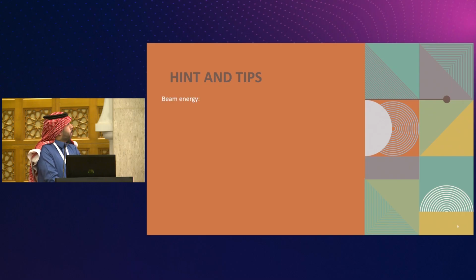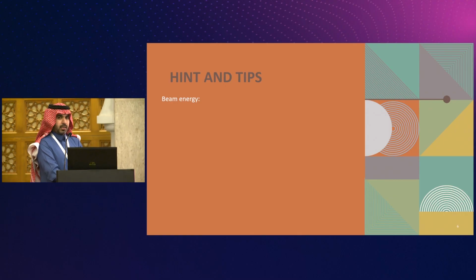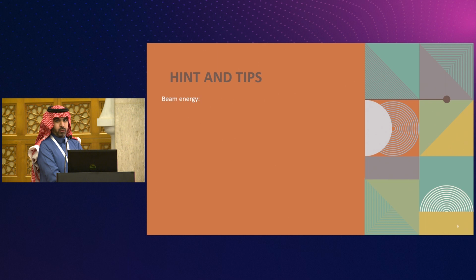So the first thing that we're dealing with when it comes to head and neck imaging, or any imaging, is the beam energy, which is kVp. That is the starting point. If you spot on the kVp correctly, then everything will be fine. Because that's the beam energy, that's the power of your beam spectrum. Lower kVp yields better contrast for bone and iodine. Are you looking for bone or looking for contrast? Then lower kVp. If not, go higher, 100 and above.